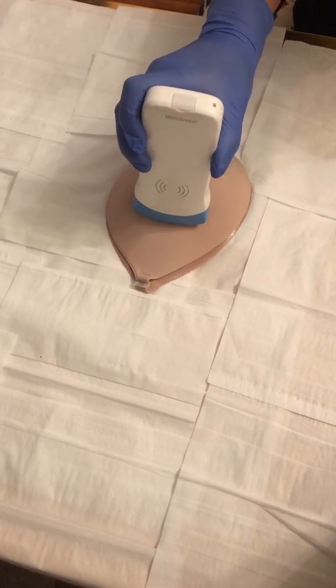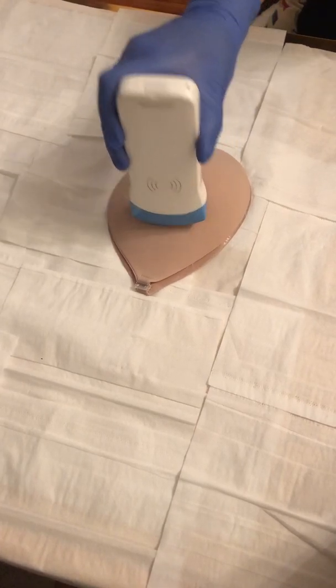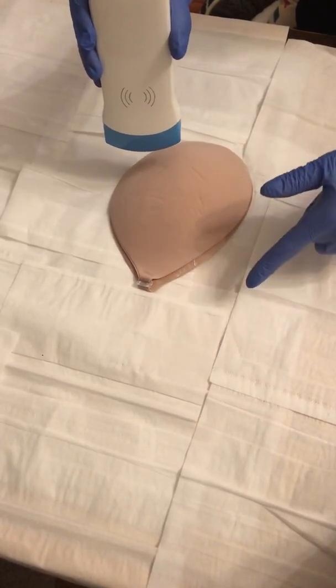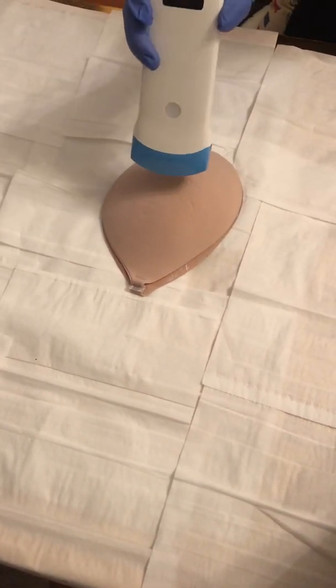So we would image at 1 o'clock, 3 o'clock, 6 and 9. We would also remember to image the nipple and the axilla, and that is the entirety of the radial and anti-radial scanning planes.